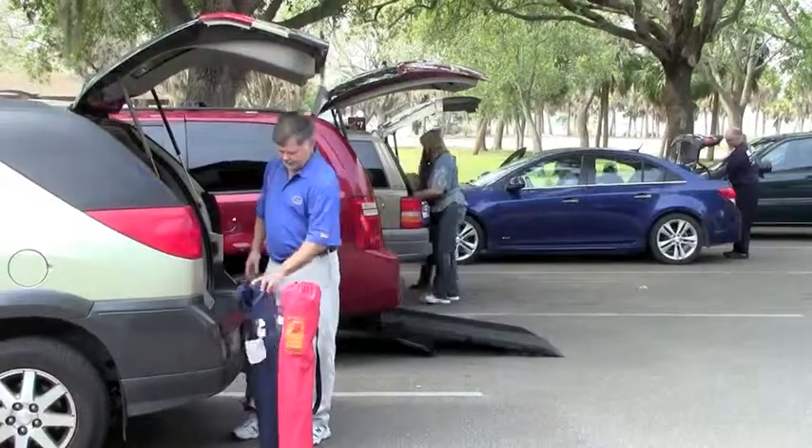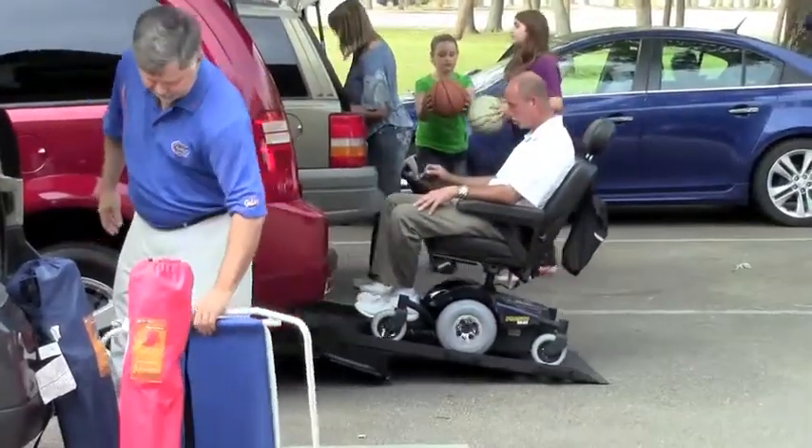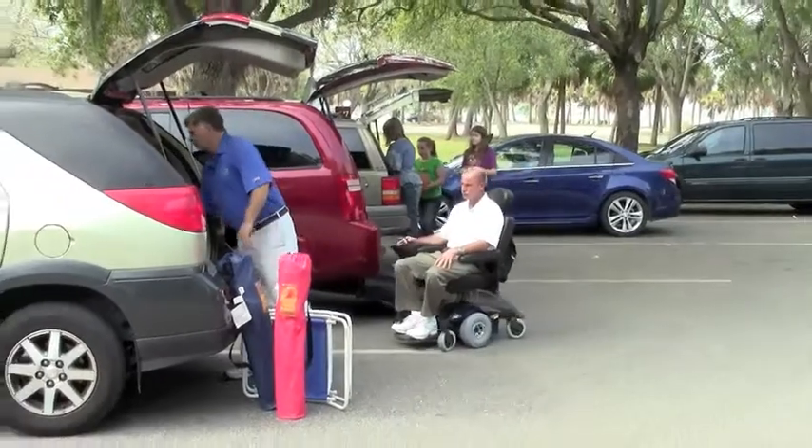Loading and unloading from the rear of the van is normal, and our wheelchair ramp doesn't come out any further than what you're normally used to with your SUV or minivan.